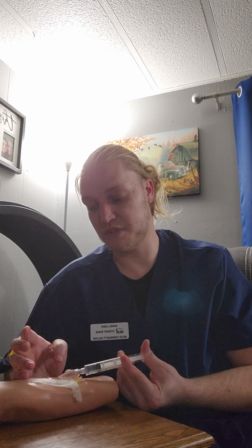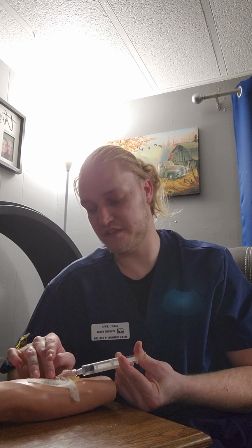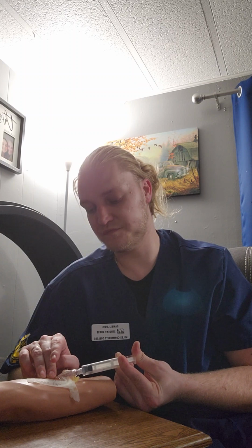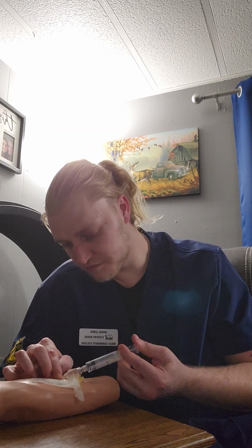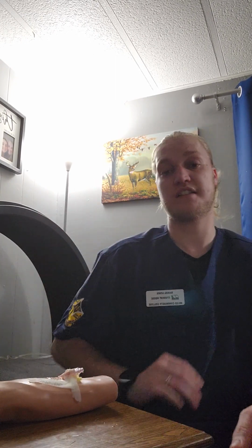So I'm going to go ahead and do that now. So I'm flushing again, 5 milliliters of solution. Okay, and it is flushed. And now I would clean up all my stuff, go document in the MAR, everything like that. Alright, so for this last part, this is discontinuing the IV.